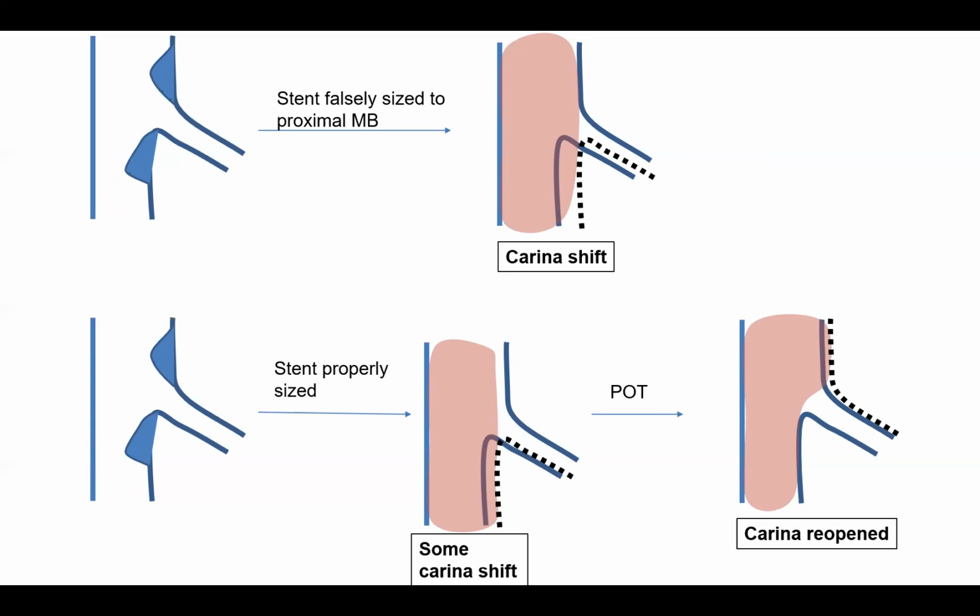That's how POT can actually improve a side branch stenosis. If you had side branch stenosis after main branch stenting and you do POT, the side branch stenosis may actually improve. Another thing POT does is open the stent struts into that side branch, so it makes it easier to rewire, and it creates good apposition in the proximal portion of the vessel, which allows you to rewire that side branch without going behind the struts. If you rewire without POT, your wire will have a propensity to go behind the struts. After POT, it will help you wire properly through the stent struts, not behind them.